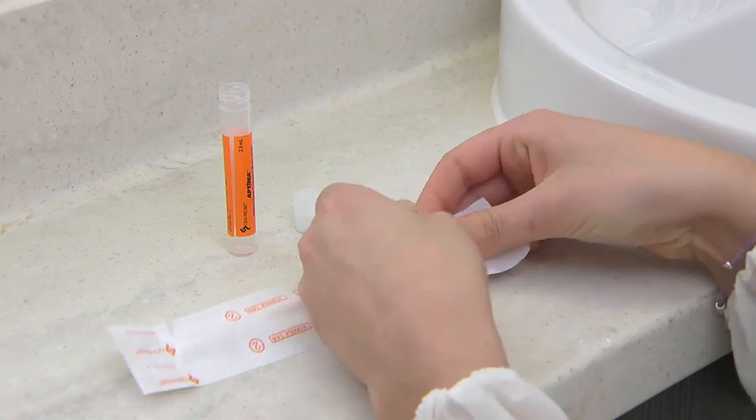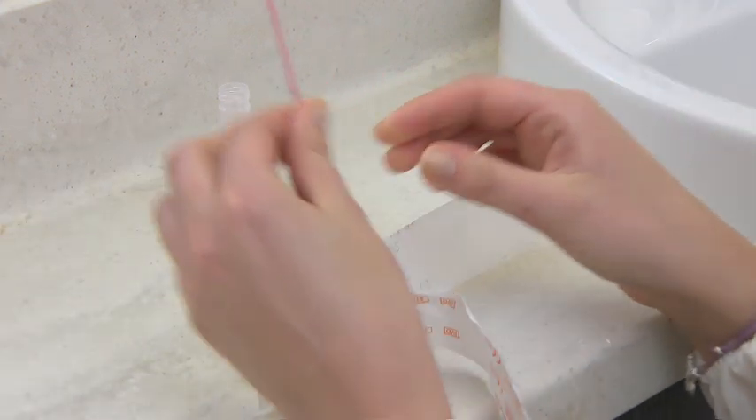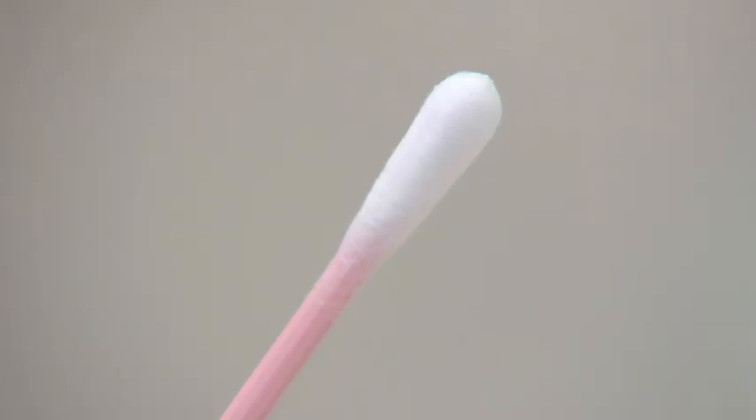Remove the cotton bud swab with the pink shaft from the paper pack with the orange writing. Be careful not to touch the cotton end of the swab.